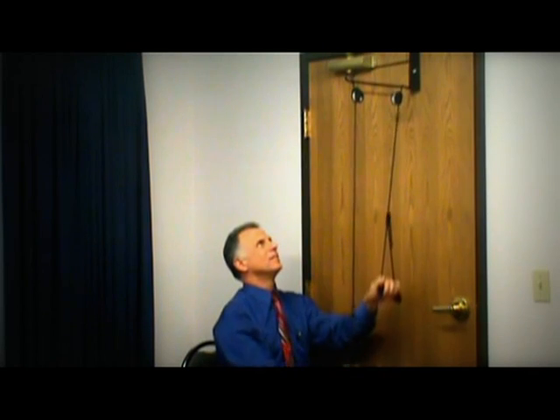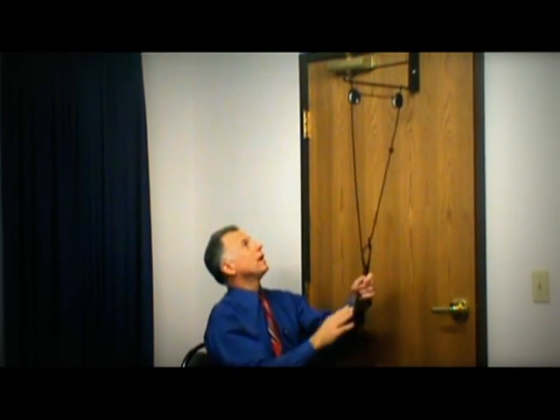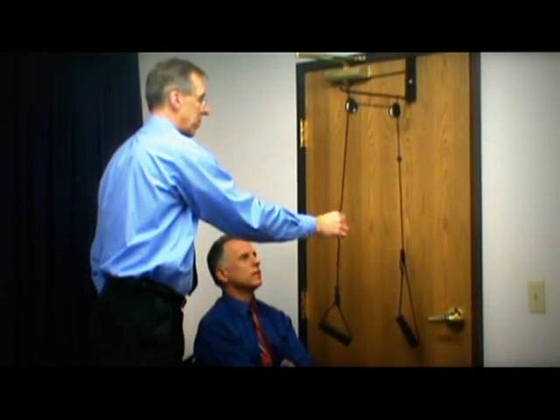Functionally it works, but you can certainly make a better one if you've got anybody handy around the house. Yeah, and this is kind of a double pulley system, cheaper too. And quite often you really just need one pulley. Yeah, I don't know why they have two on there. And nylon rope. So we can come back here, Brad, we can just talk about this real quickly.